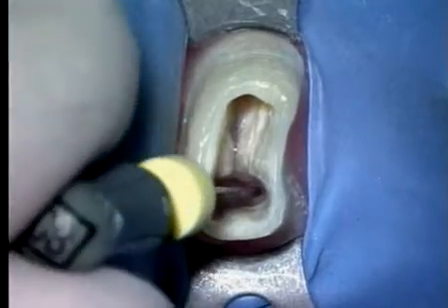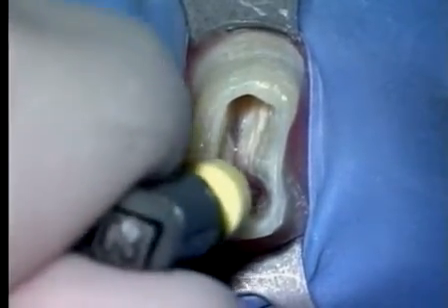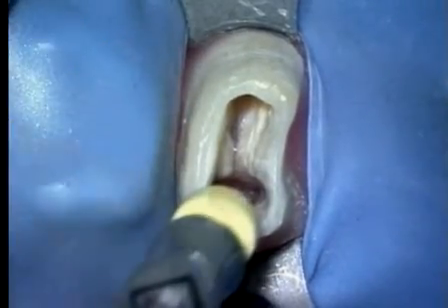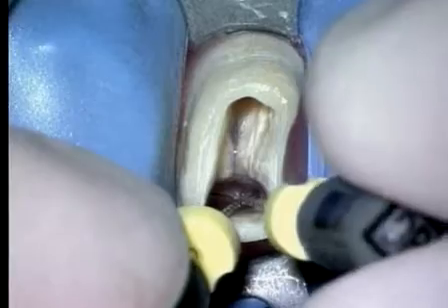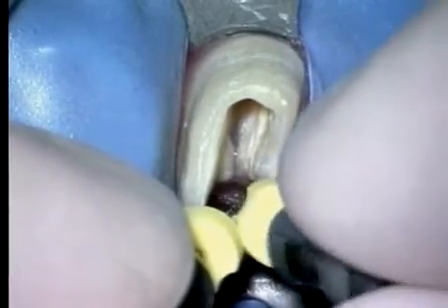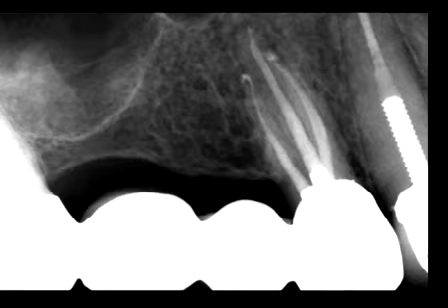Following coronal disassembly and isolation procedures, an access cavity was prepared. Typically in a first bicuspid, there's a single buccal orifice symmetrically positioned across from the lingual. In this instance, the MB is anterior to that imaginary line, and the DB is just posterior. Here the 08 file is being pulled down into the distal buccal system. Following endodontic treatment, the bridge was reassembled, and the postoperative film shows the work.